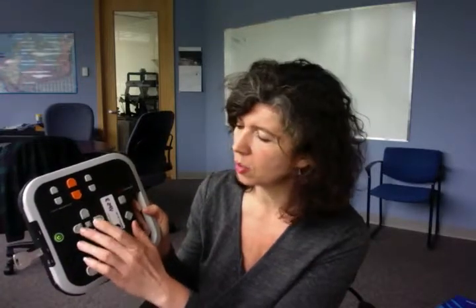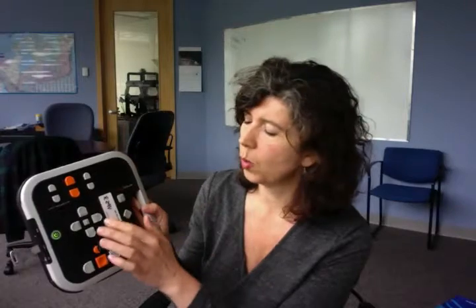We have the navigation buttons here that we're familiar with. I'm currently on book number three. If I want to back up: book two, book one, book 20.